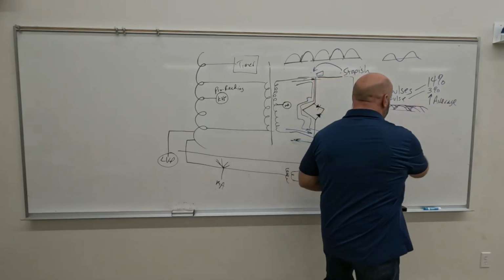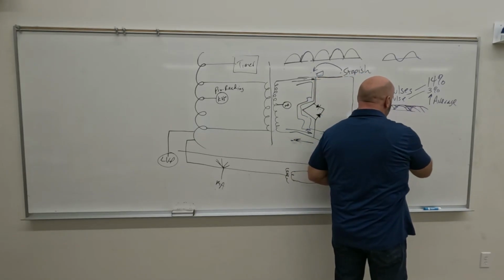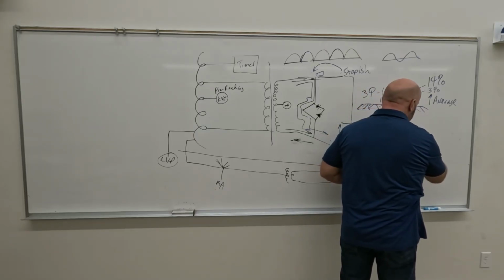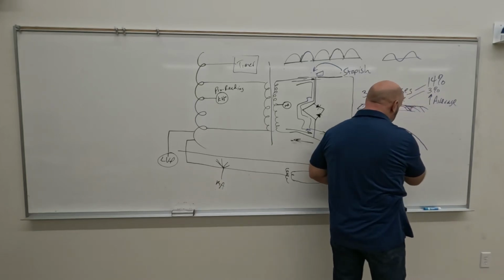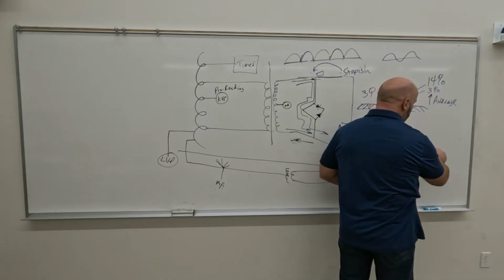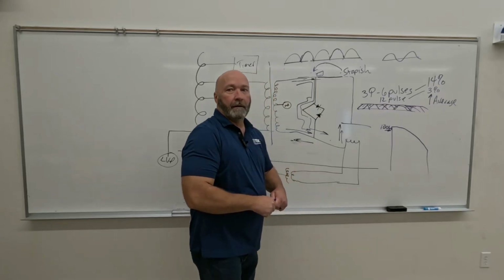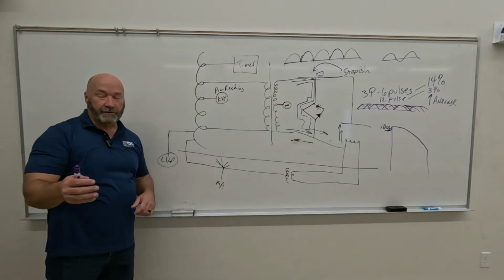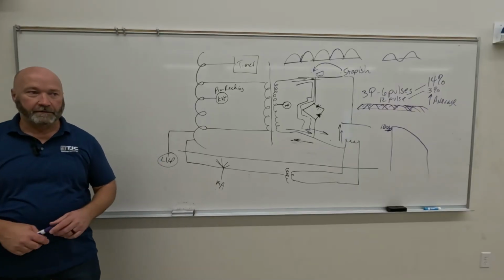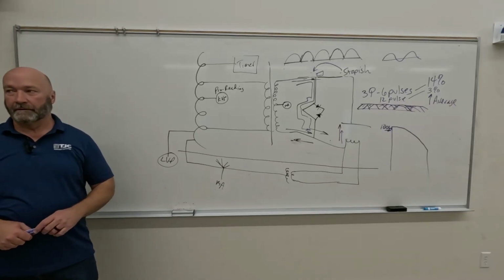With a capacitor discharge, let's say you set 100 kVp, and the kVp starts at 100, but as we lose electrons, the kVp drops throughout the exposure until it gets to either the end of the exposure, or it gets low enough that it just is ineffective anymore. Okay, so capacitor discharge, what drops? kVp, right, as opposed to falling load generators, where MA drops.